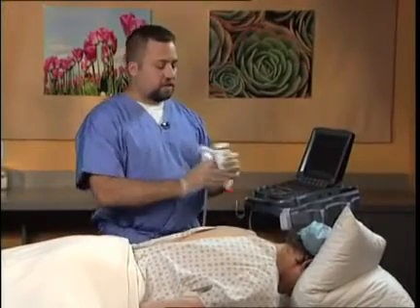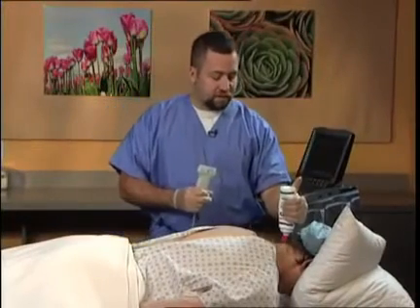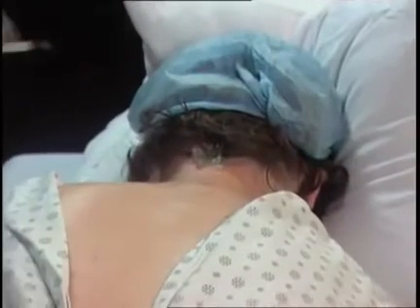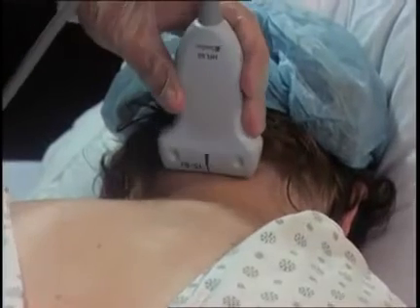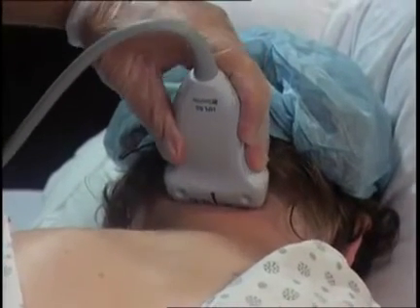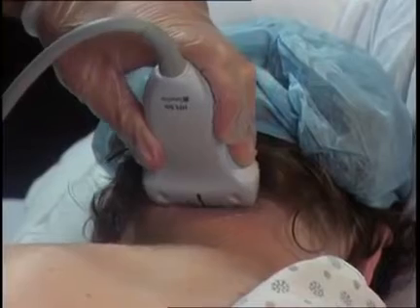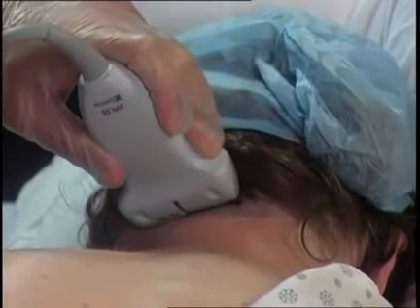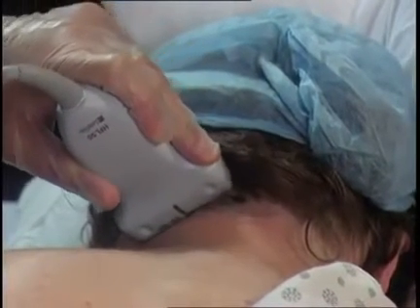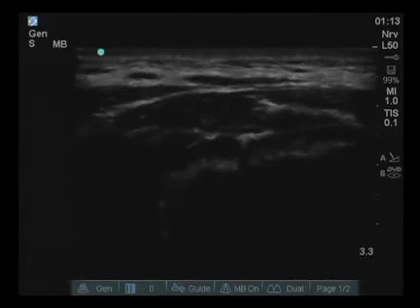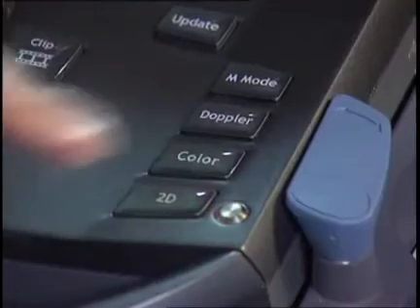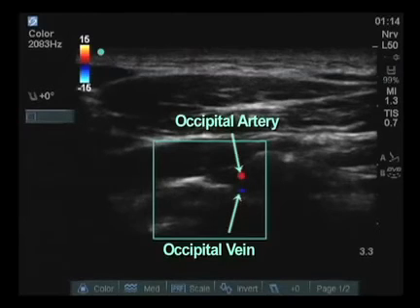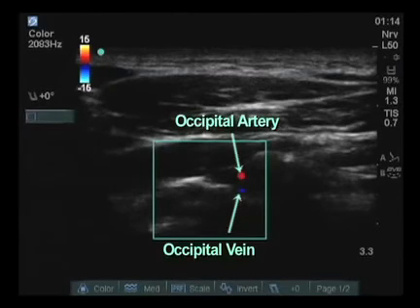To commence, the target site is covered with a thin layer of ultrasound gel. The probe is then placed in the transverse application at the midline and gently rolled out. In the midpoint of the screen at this point, when turning on the color flow Doppler, we will be able to identify the greater occipital artery.